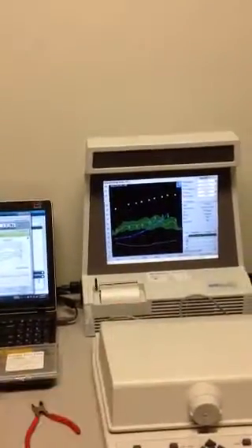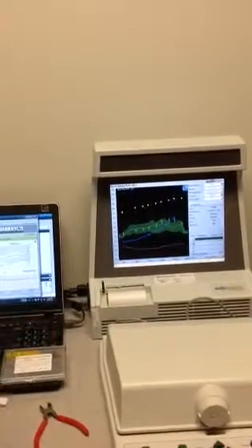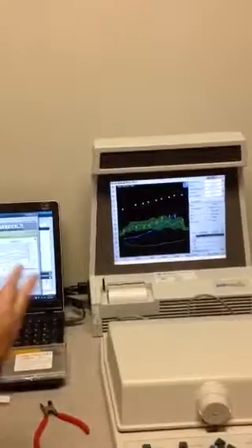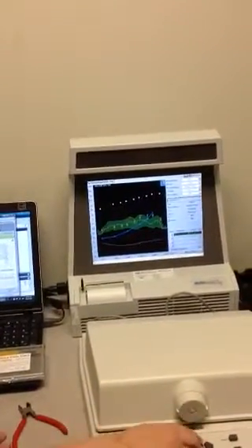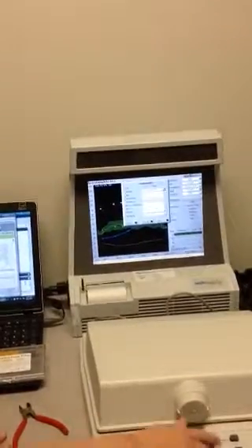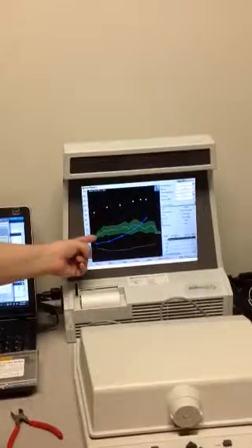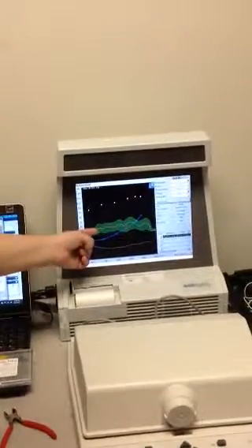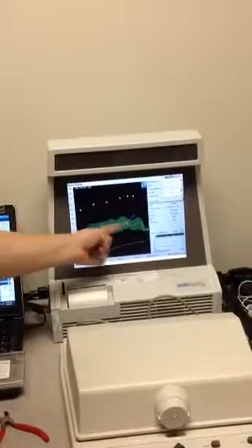So we could go in and start adjusting, but it's going to sound weird to you because your hearing is normal. So I'm just going to leave it a little bit below what we want. So we're matching to a target. If you wanted to match to sensation level, which is what we typically do, all you have to do is say you don't want to see a target. It'll remove that. And then you're going to take that middle line, the average, and make sure at a 55 dB input it is at threshold.